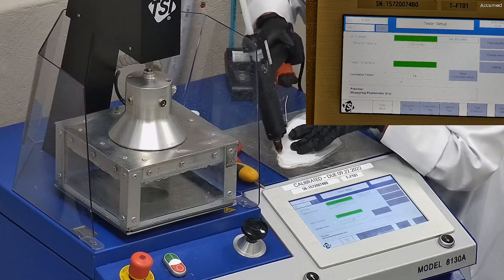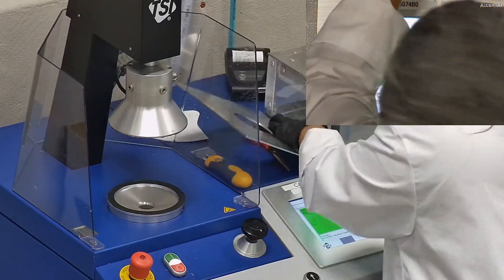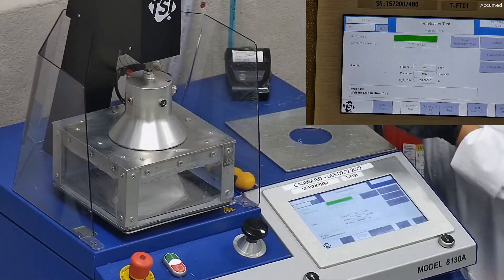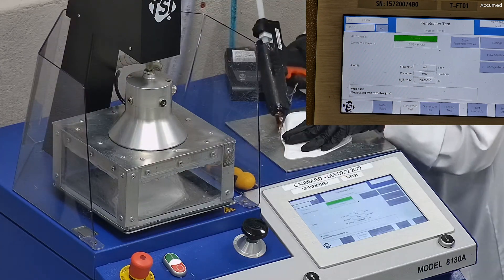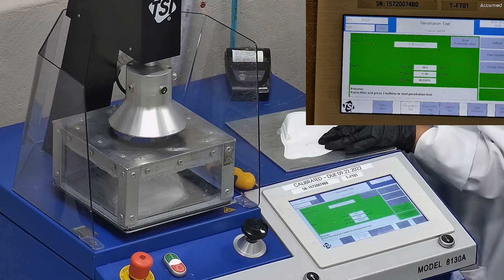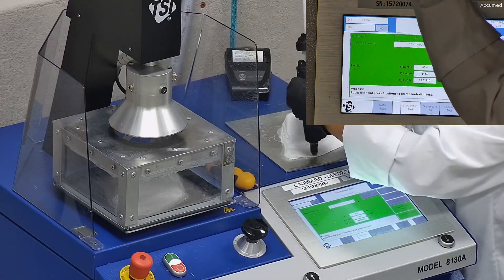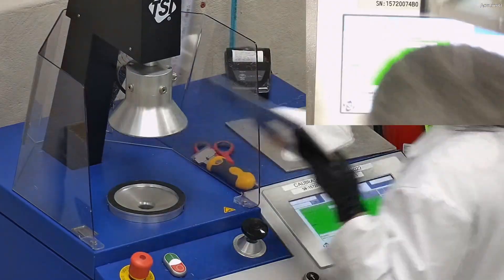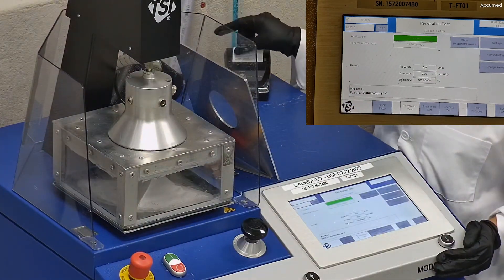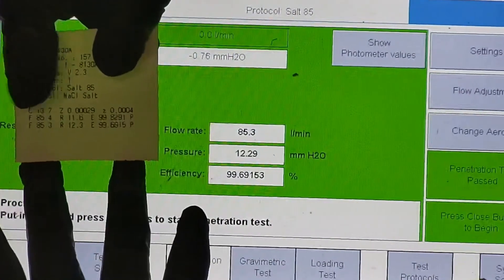F stands for airflow rate, which we test at 85 liters per minute. R is for resistance, also referred to as pressure drop — this correlates with breathability, so the lower the number, the more comfortable and breathable the mask is. E stands for filtration efficiency percentage. The first sample had a filtration percentage of 99.83% and a pressure drop of 11.6 millimeters of water. The second sample had a filtration percentage of 99.69% and a pressure drop of 12.3 millimeters of water.